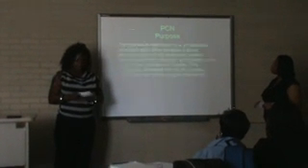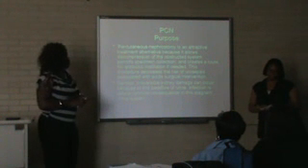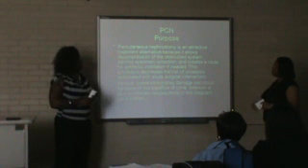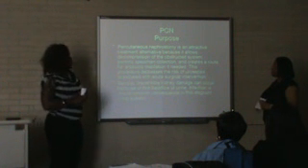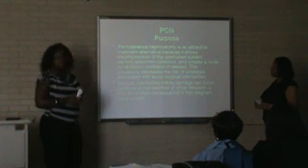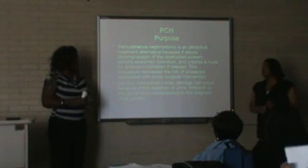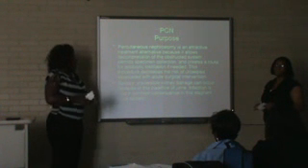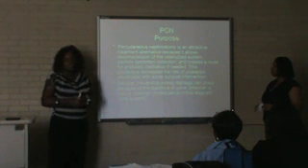The purpose of having a PCN procedure. Percutaneous nephrostomy is an attractive treatment alternative because it allows the decompression of an obstructed system. It permits specimen collection and creates a route for antibiotic instillation if needed. This procedure decreases the risk of urosepsis associated with acute surgical intervention. Serious irreversible kidney damage can occur, and stagnant urine can cause a lot of infection within the body.